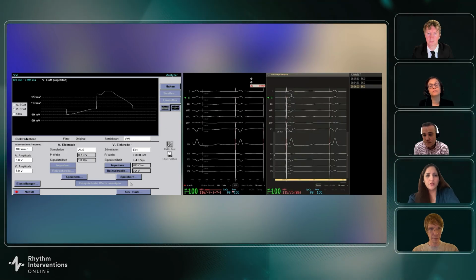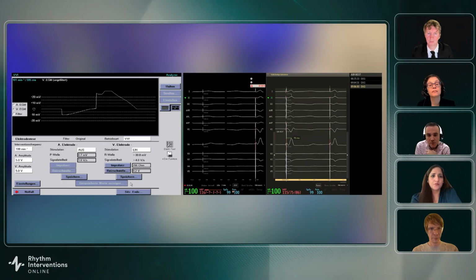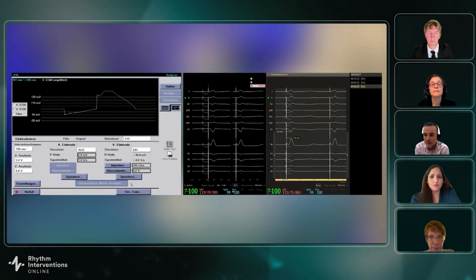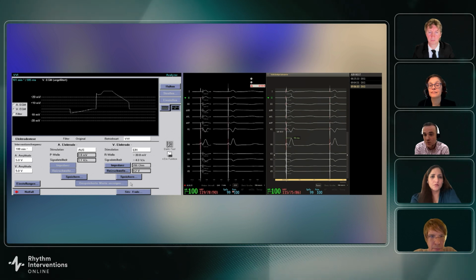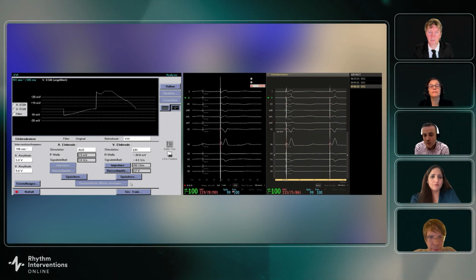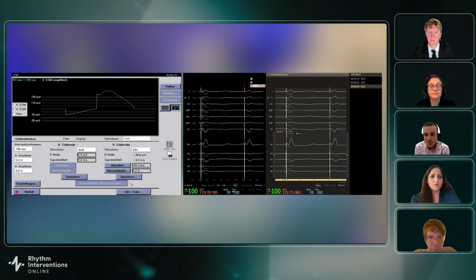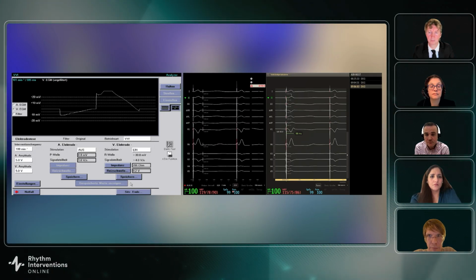And what was your unipolar impedance here? It was 600. Here you can see it's 700, I'm sorry. 700 ohm on the left side, so a little bit of decrease in the impedance, which was expected. And here it was 70 milliseconds, so there was no transition in V6. So we look at the R wave peak time in V1. And here with 0.2 volt, it was around 100 milliseconds. So we go for a high output. We went for the high output and also performed all measurements again.